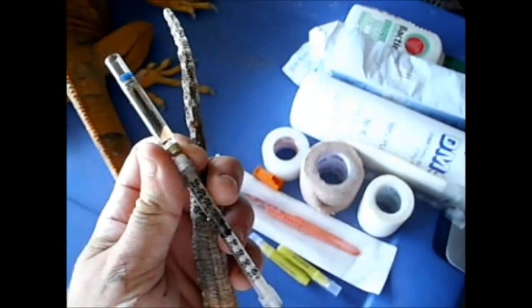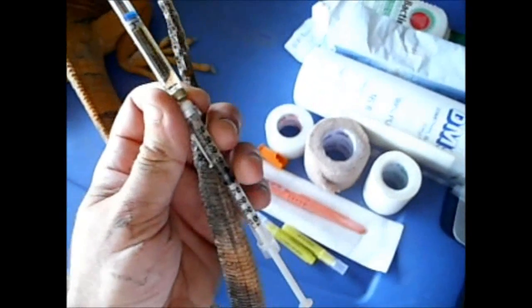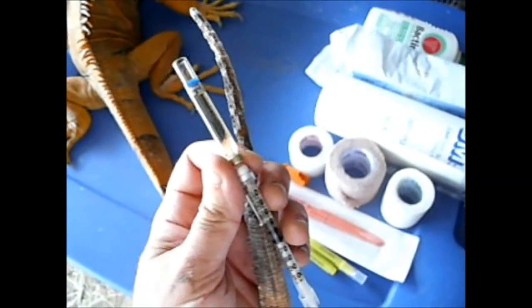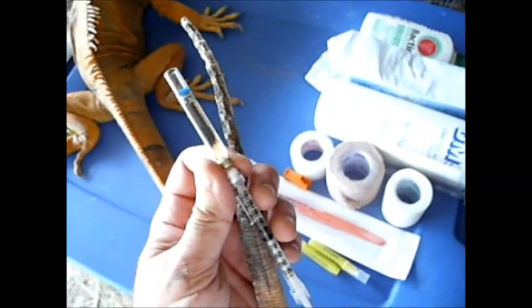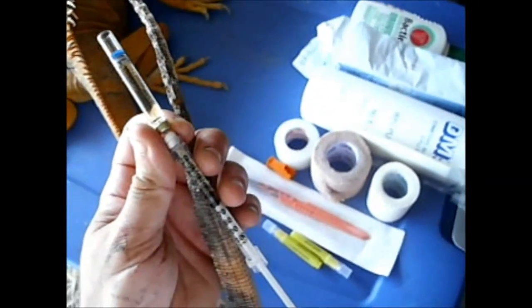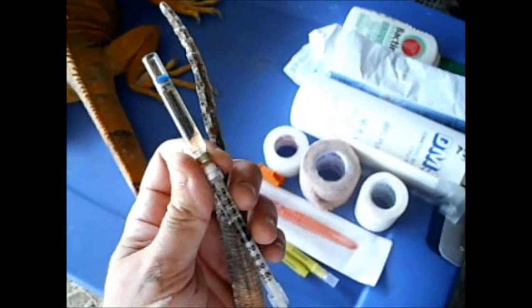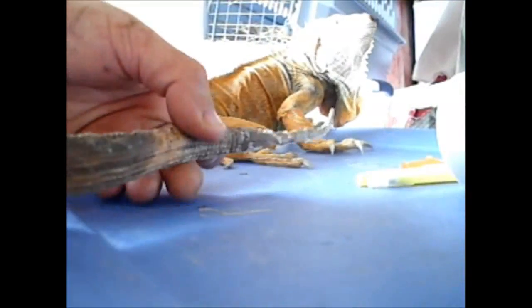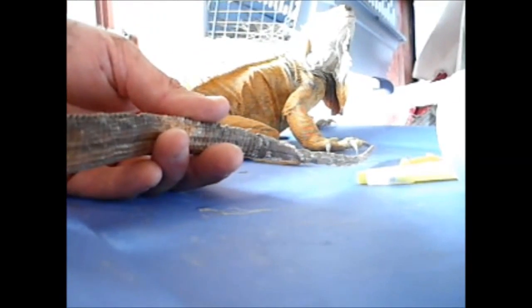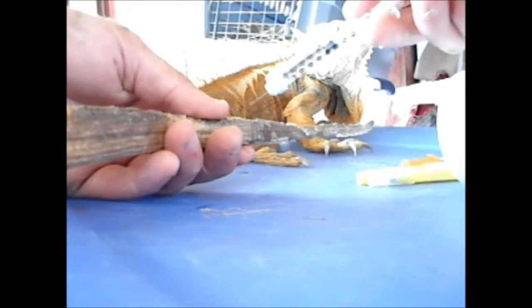And what I'm going to do here, I'm going to give him a ring block here of some Vivocaine, which is pretty similar to what you'd get at a dentist office for oral surgery and whatnot. And so that will deaden his pain, and we'll go ahead and take the end of that tail off. Okay. I don't have a camera stand with me at the moment, tripod, so I'm just going to go ahead and do it like this and hope you can see.